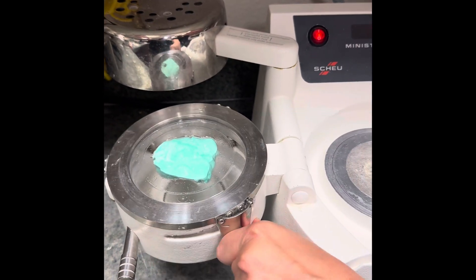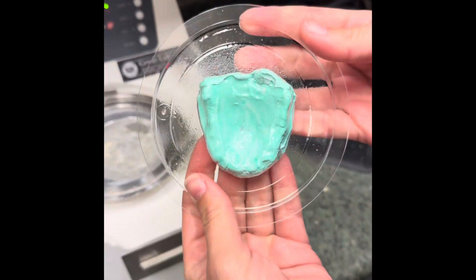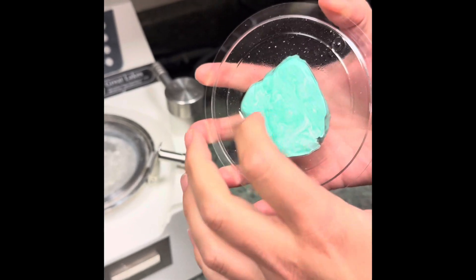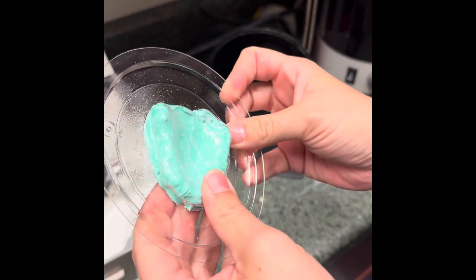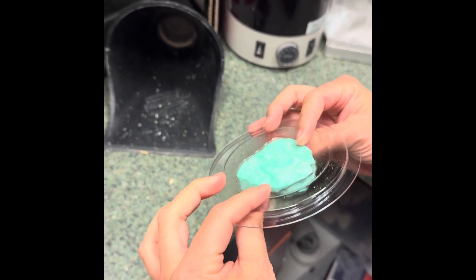It looks like we got it. Ta-da! Nice. Very nice. Nice and hard — stuff's hard now too. Okay, yeah, so we didn't bake it. We didn't bake goo.